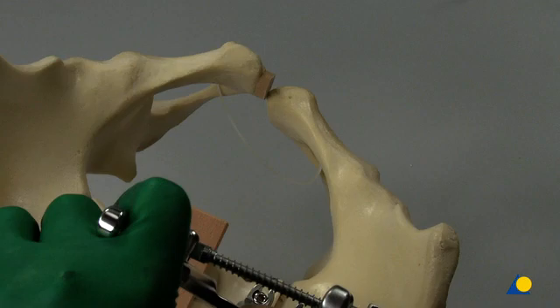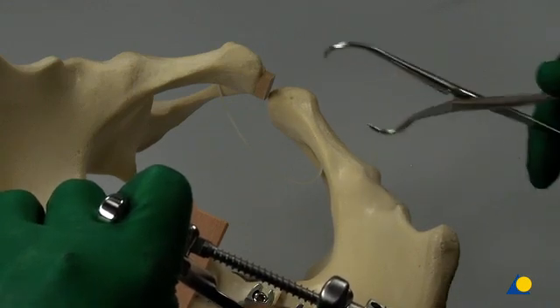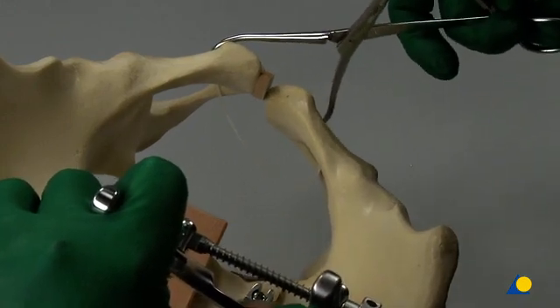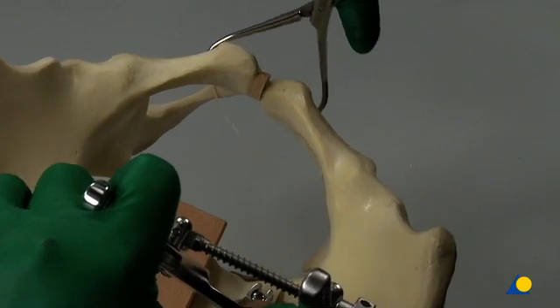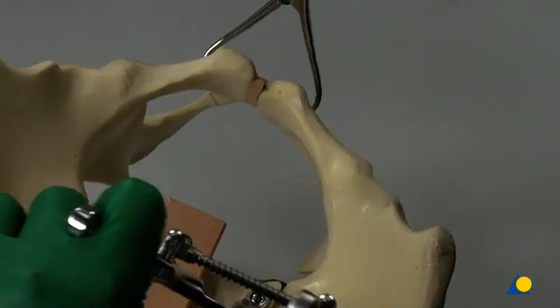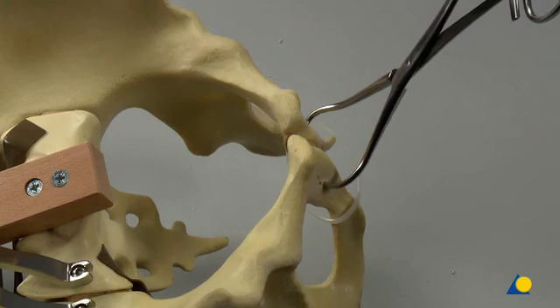To make sure that no flexion-extension deformity persists, the anterior part of the pelvic ring is exposed through a Pfannenstiel approach. Reduction is then completed by means of a pointed reduction forceps introduced either into the obturator foramina or into the pubic bodies.